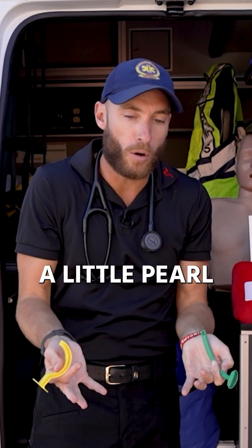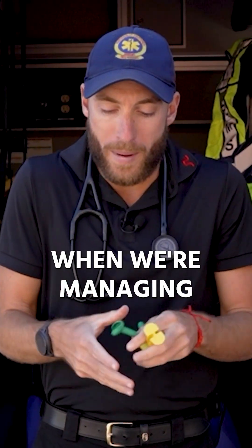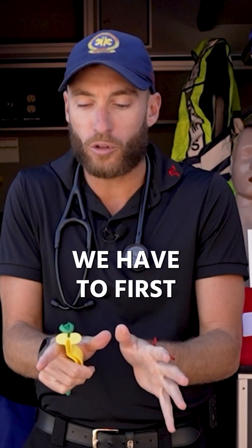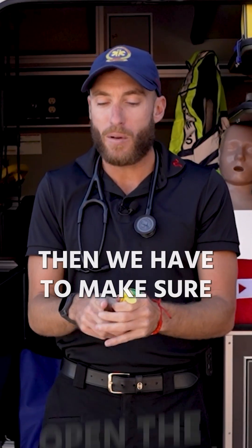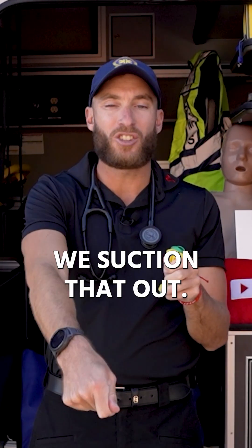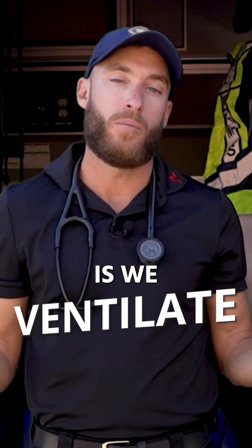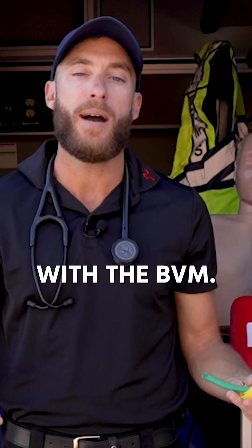I'm going to show you a little pearl, a little education tip you can take right now. When we're managing someone's airway, we have to first open the airway. Then we have to make sure the airway is clear — any blood or any vomit, we need to suction that out. Then we keep it open with an airway adjunct. And then step four is we ventilate at the basic level with a BVM.